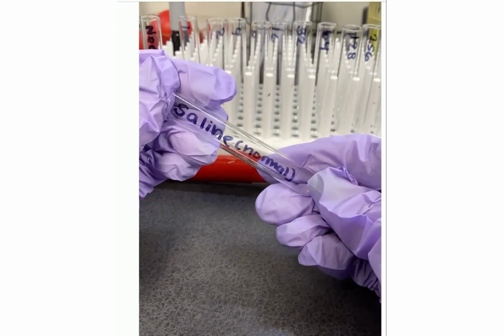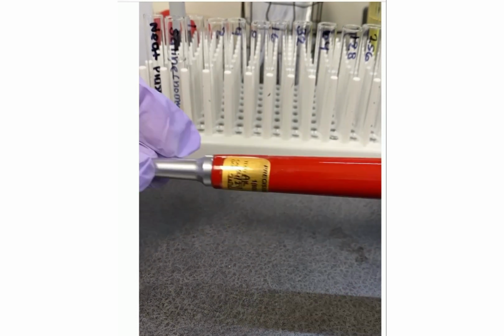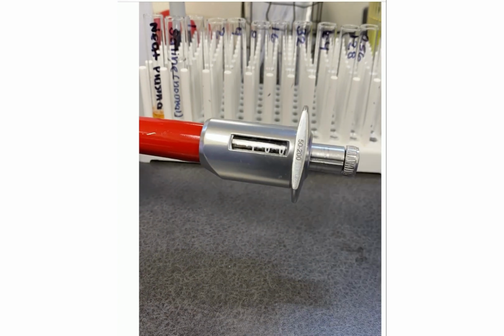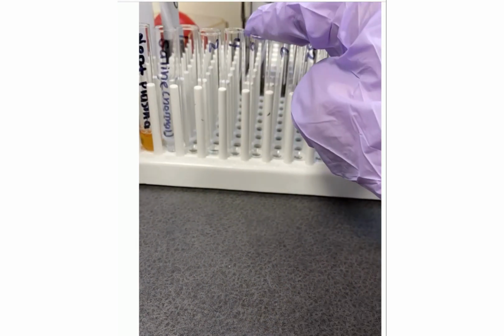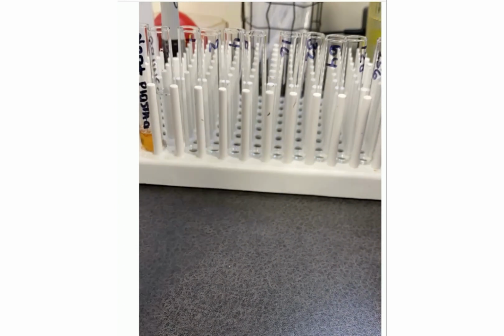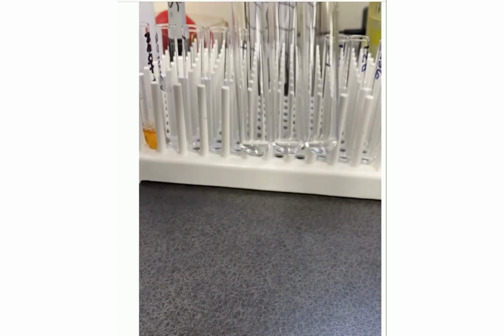So I'll add saline to this tube that I've listed as saline. Then I'll take 100 microliters in a calibrated pipette, and I'll add saline, 100 microliters, to tubes 2 through 512. As you may have noticed, I did not add saline to tube number 1.